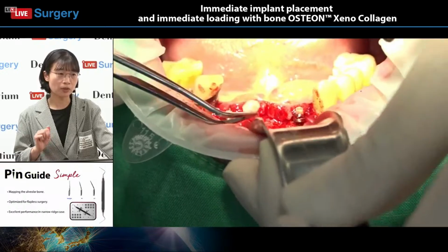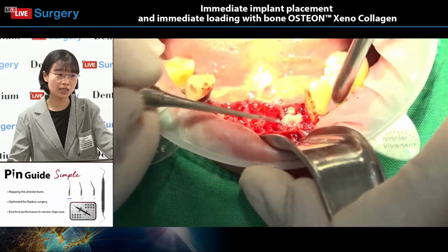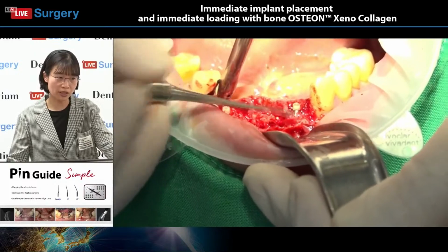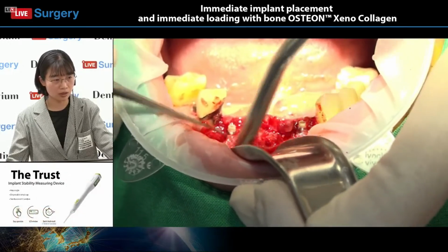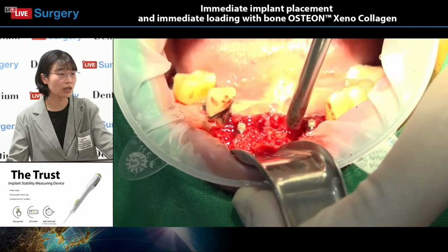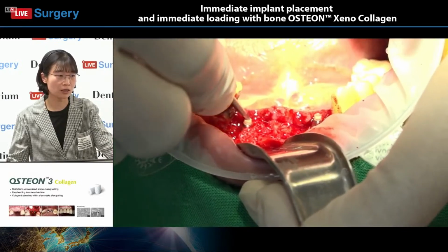We can just apply it with the pin set like this. So it is very easy and simple. Just put the bone graft materials and then press down the materials with the instrument, right? Such as the periosteal elevator or the pin set. Any tool is good.